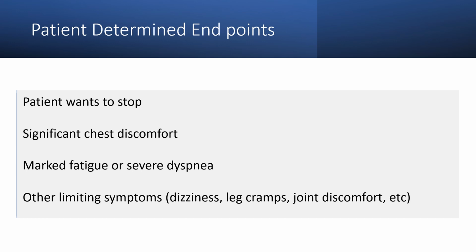Some patients are determined to push through thinking that there is a pass or fail, or this is like climbing a mountain. It is useful to tell the patient that there is no specific endpoint, there is no pass or fail, and they should not overexert themselves to exhaustion.